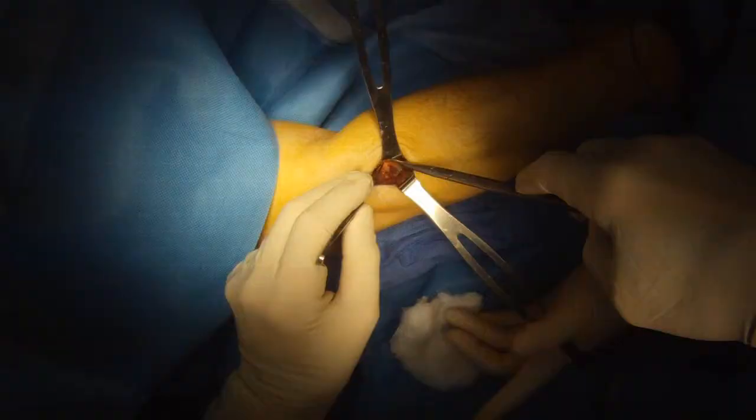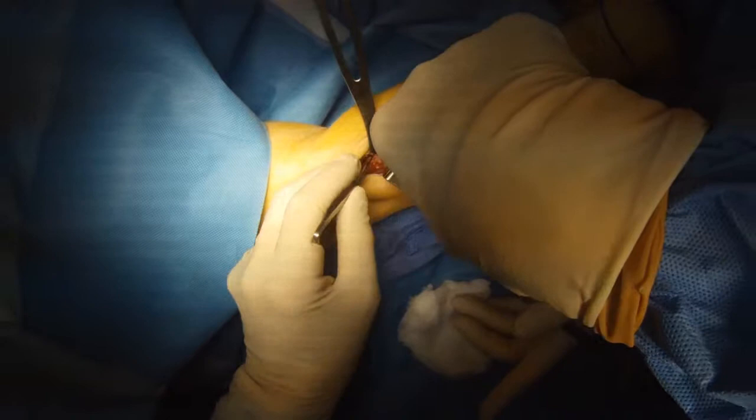You can see the nerve is free. There are, however, some veins over the nerve — this is common. These can potentially constrict the nerve as well.